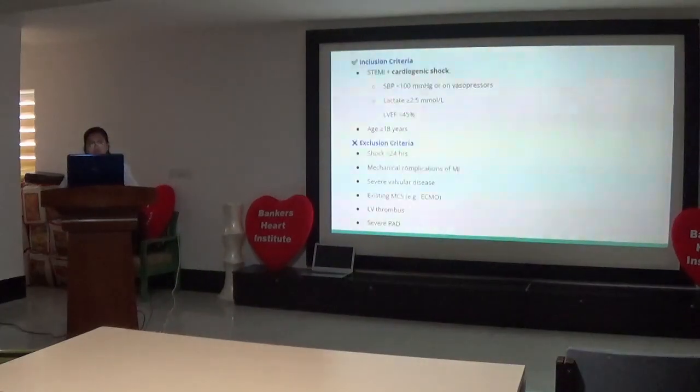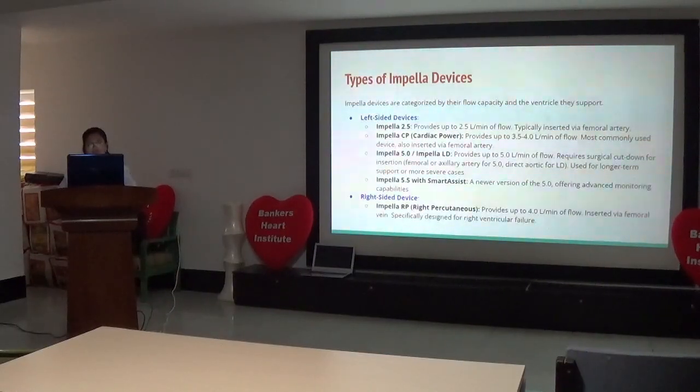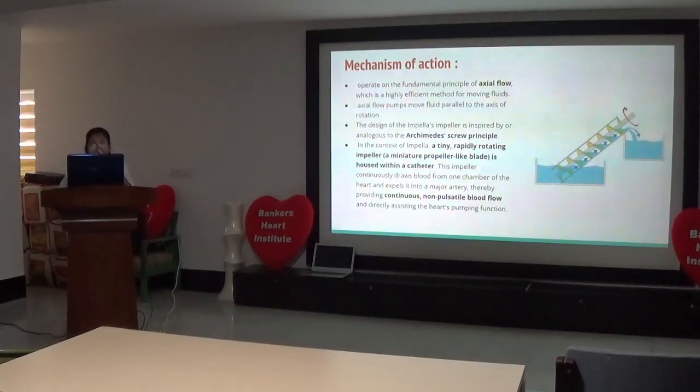The first slide had something like impeller. Impella. It is the motor, the one who drives. So impeller is basically a Latin word meaning to push. To pull and push. It pulls the blood and then pushes it forward, functioning practically. Pull from the lower to just push. Like a push cart. Rocket. A 20 lakh push cart.